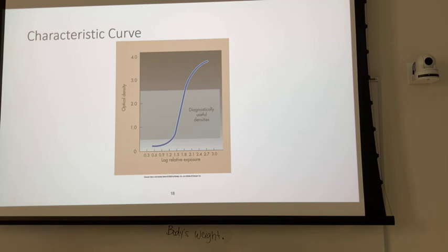Well, if I underexpose this patient, what's going to happen? I have to repeat. The computer's probably tracking how many repeats I'm going to get, right? Administration may come to me and say, you have a problem because you're repeating all these exams. So what are they going to do? Continue to shoot with low technique? Increase it a little bit. Maybe even increase it past what is ideal, intentionally. That's what we call dose creep.